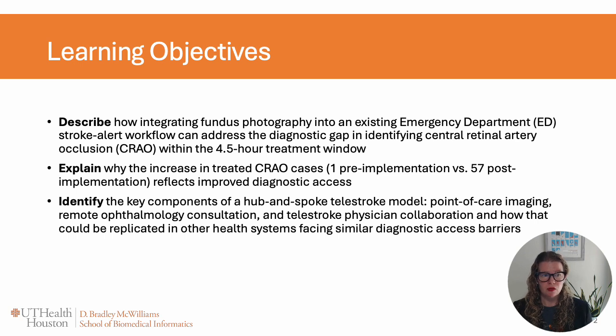So the key learning objectives for today are to describe how integrating fundus photography into an existing stroke alert workflow in the emergency department setting can actually address the diagnostic gap in identifying central retinal artery occlusions within the treatment window, explain why improving access to diagnostics for central retinal artery occlusions may actually impact the treatment, and identify the key components of a hub and spoke telestroke model. So the point of care imaging, ophthalmology consultation, and all the way through to treatment.